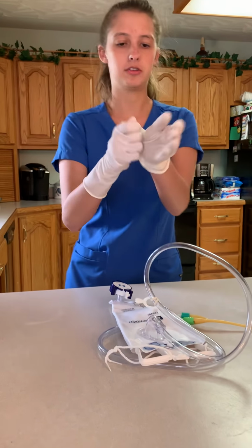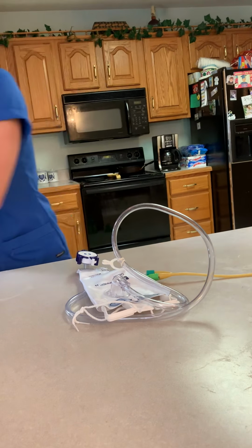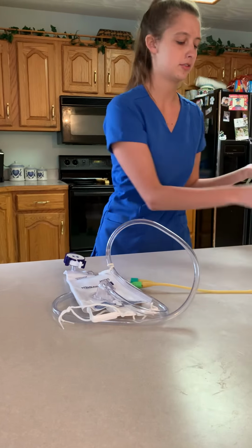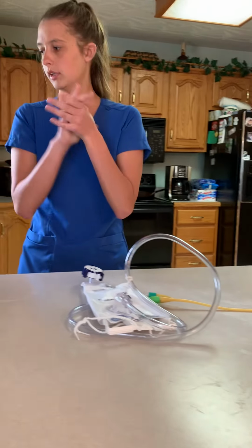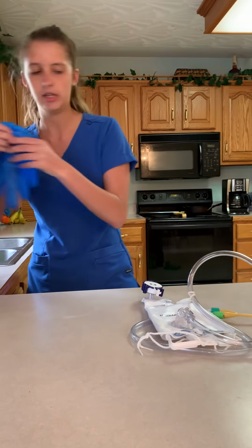I'm going to remove my sterile gloves. Okay, and then I'm now going to wash my hands now that I've removed my sterile gloves. Okay, and I am now going to put on a new pair of clean gloves.